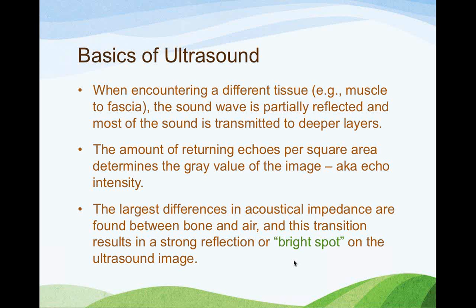Because once it becomes severe, you have so much reflection of those sound waves that you cannot pass through deep enough to actually visualize that bright spot. The importance of that bright spot is also related to your probe. It also signifies that you're in the right position or you're directly perpendicular to the bone. So it's always really important to try to visualize that if you can.